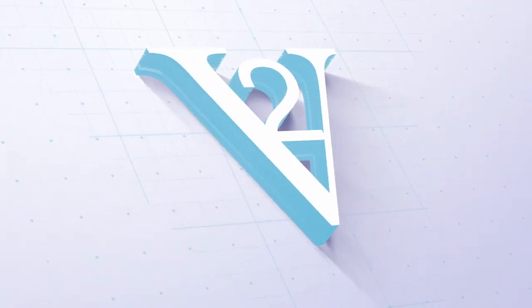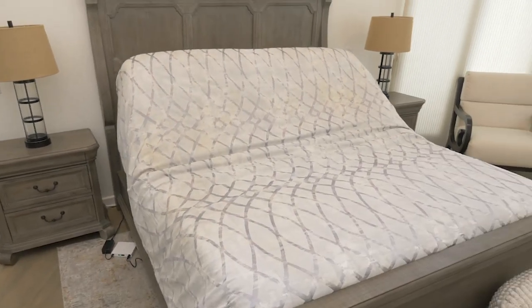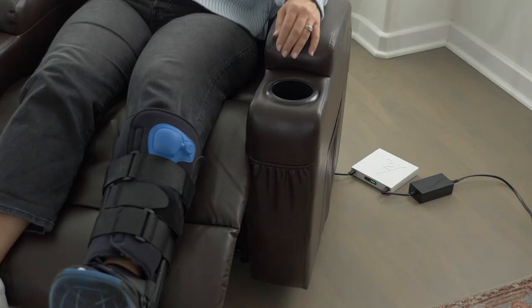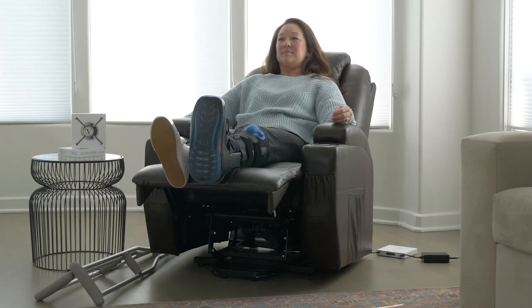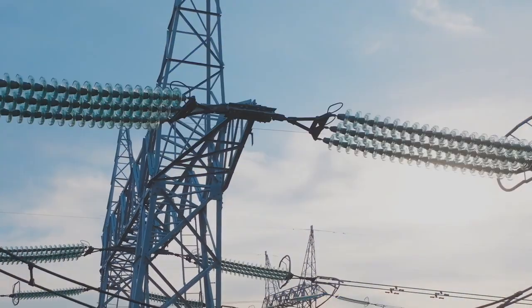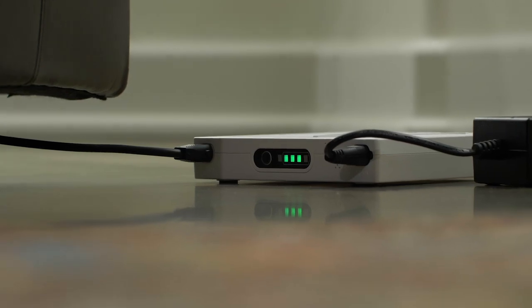The ultimate solution for powering your adjustable bed bases, lift chairs, and power motion furniture during a power outage. Introducing the Vault. Its compact design seamlessly integrates with your furniture while still giving you peace of mind. With its automatic sleep mode, the Vault springs into action when the power goes out, ensuring you never lose power when you need it most.